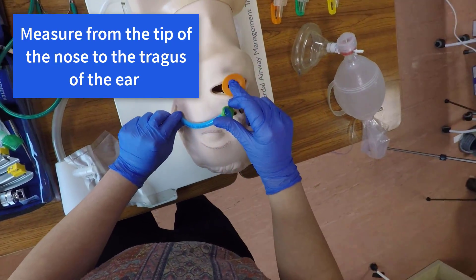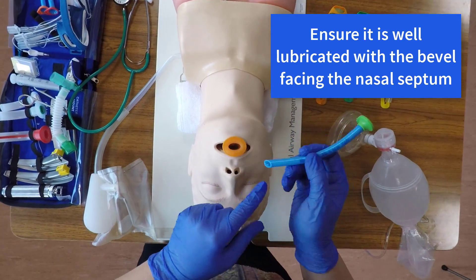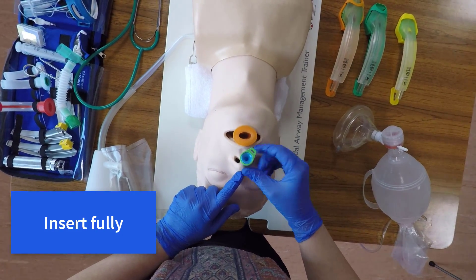The nasopharyngeal airway should be measured from the tip of the nose to the tragus of the ear. Ensure it is well lubricated with the bevel facing the nasal septum. Insert it fully.